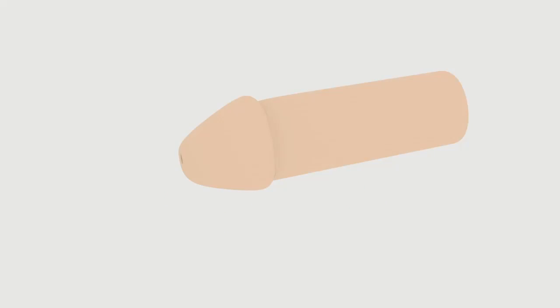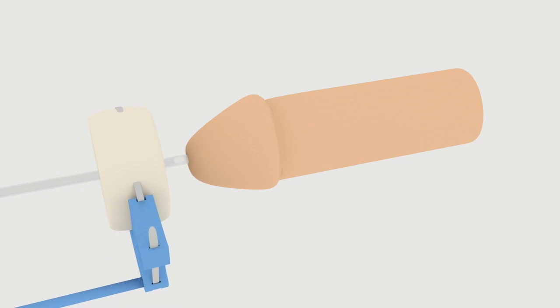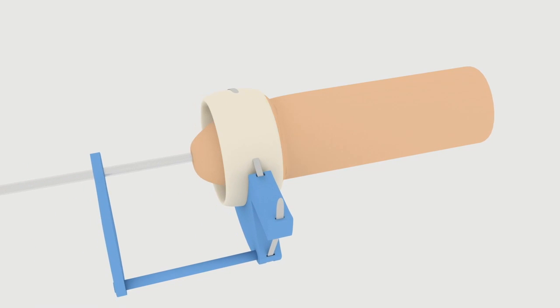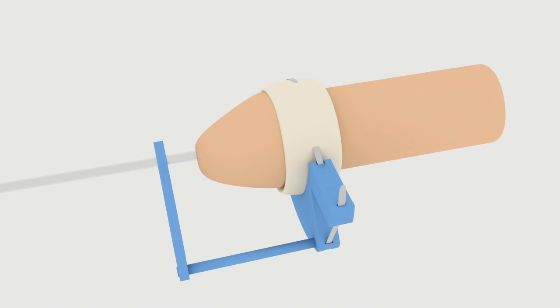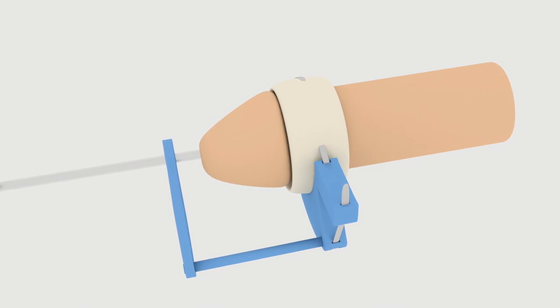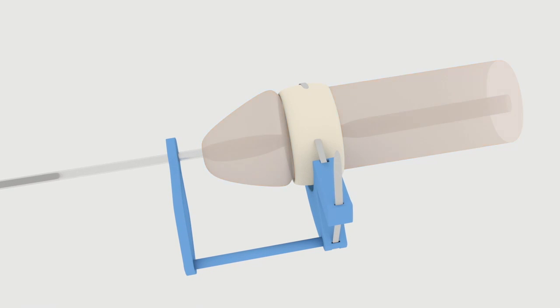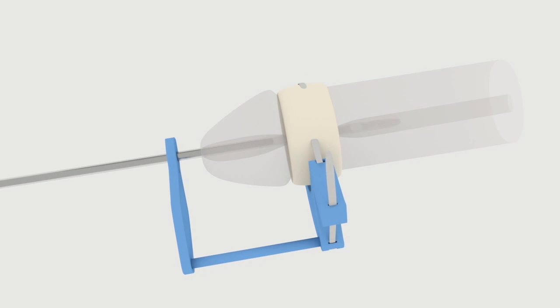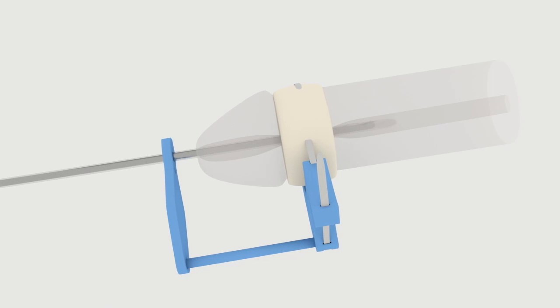Insert the catheter into the urethral meatus, and move the device slowly until the ring is positioned just behind the corona of the glans. Then apply external compression by tractioning the band, so that the ring prevents the contrast material escaping from the urethra.